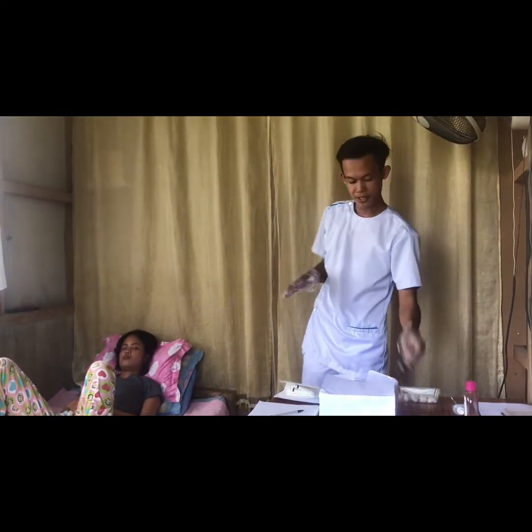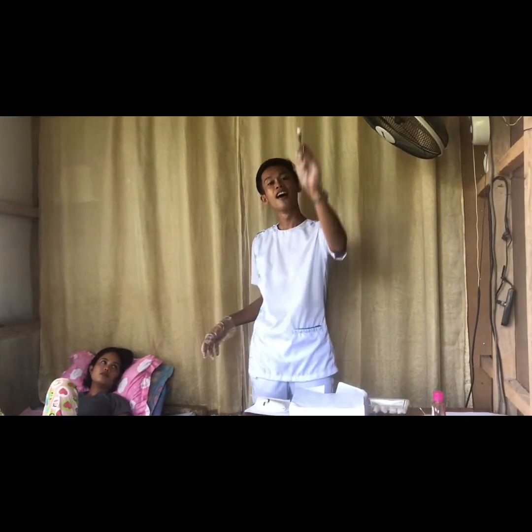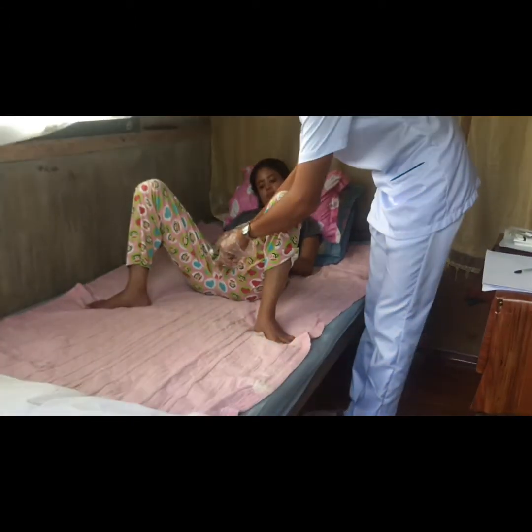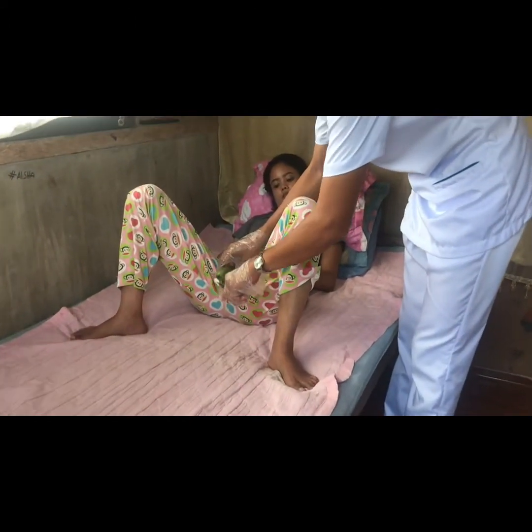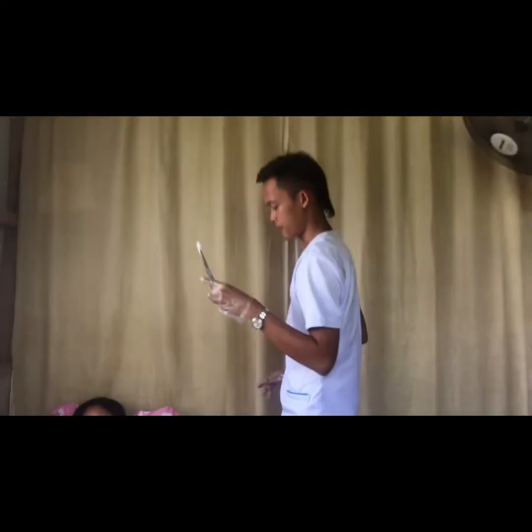So the equipment that we're going to need for the procedure is the cotton balls, the forceps, and a basin containing disinfectant solution. The first thing we're going to do is grab the forceps, and then pick up one cotton ball, and at the same time soak it with disinfectant solution, and we're going to clean the penis. Round to clean the entire surface of the penis. And then after that, we're going to throw it immediately in the garbage.